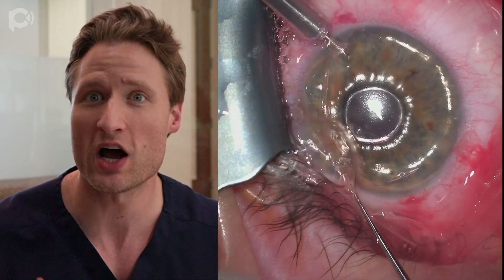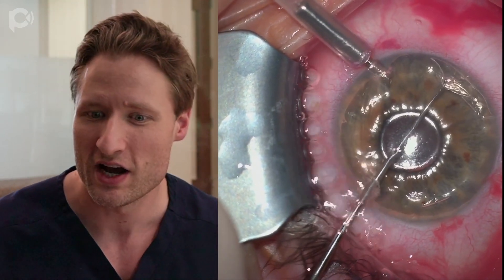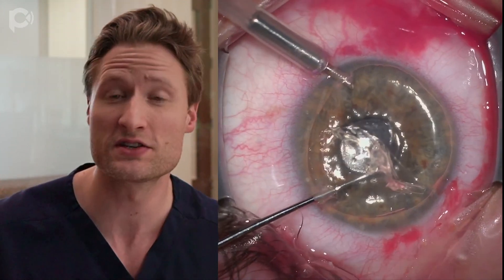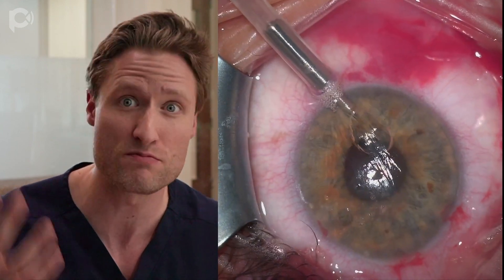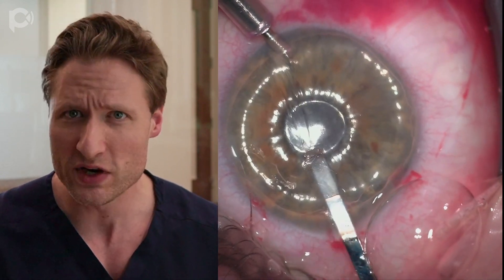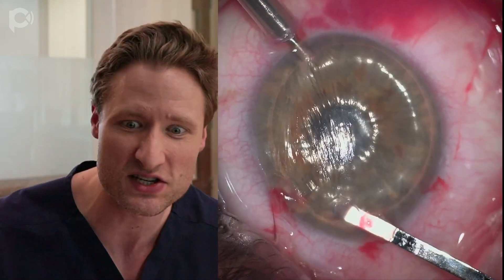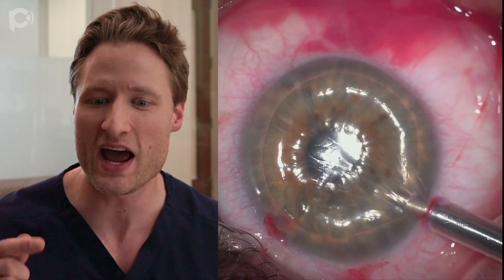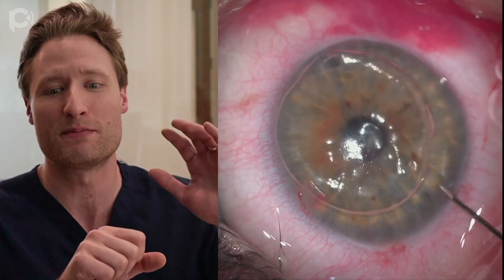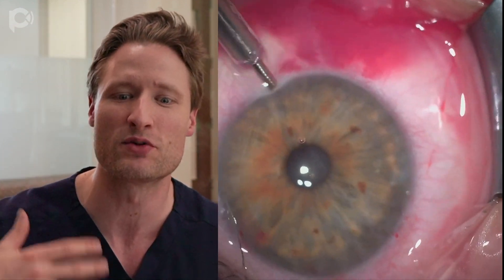This is descemetorhexis, which I always prefer to do under air, even in these phacic eyes. You may worry about damaging the patient's natural crystalline lens — with the subtenons block you often get a little dilation. Many doctors do descemetorhexis in phacic eyes under viscoelastic, but I think air is preferred because you have better contrast and visibility. You can see remnants that would be left behind better. With an AC maintainer connected to a 60cc syringe held by my assistant applying steady pressure, that keeps the chamber nice and stable and formed.